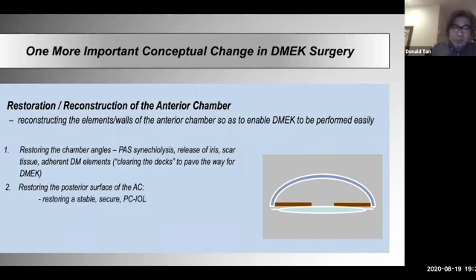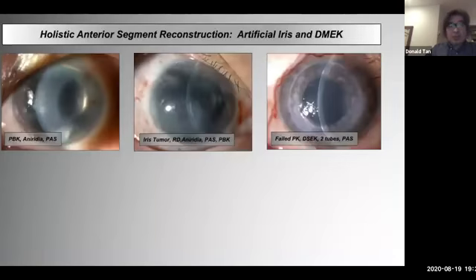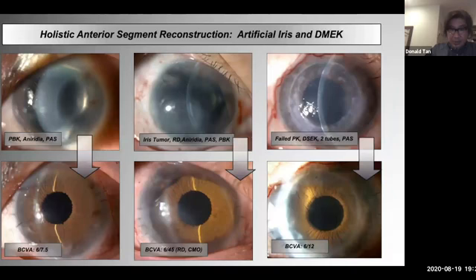But to restore the posterior surface of the AC, firstly, we have to make sure that the IOL is stable. We should remove the anterior chamber IOL, exchange it for a sclerofixated or a transscleral fixation of a posterior chamber IOL to get it out of the anterior chamber. Make sure it's stable, and then try and restore not only the iris, but the pupil. So that means removing abnormal iris and replacing it with a normal looking artificial iris. And this is the concept which I'm talking about today. So these are some cases, and can we do this? All right, and you can see the chambers are a lot more normal here.